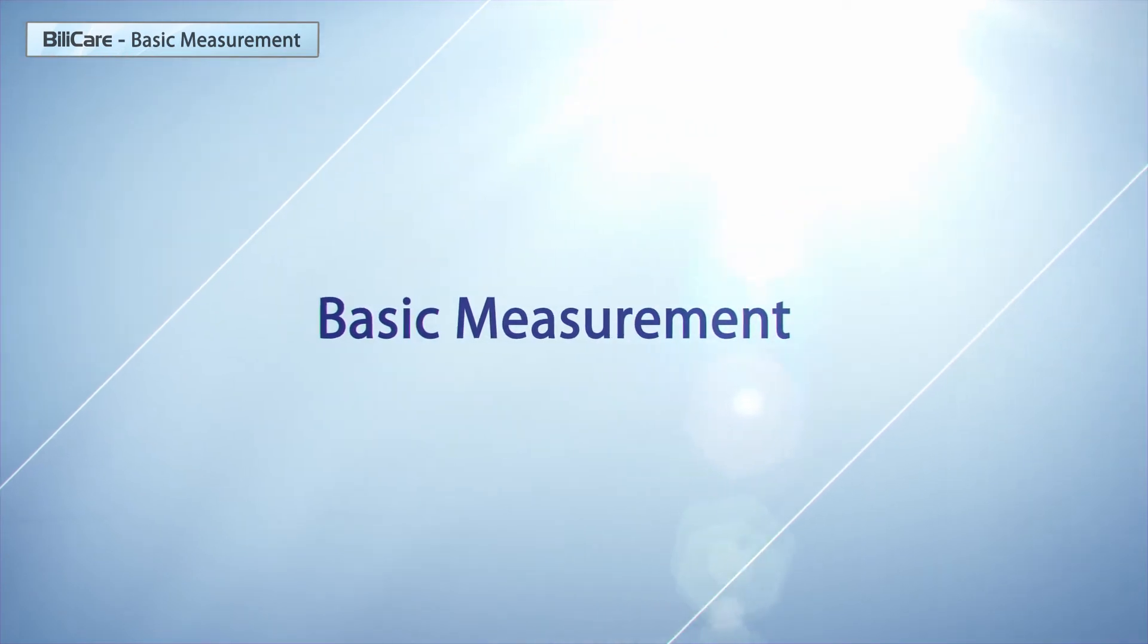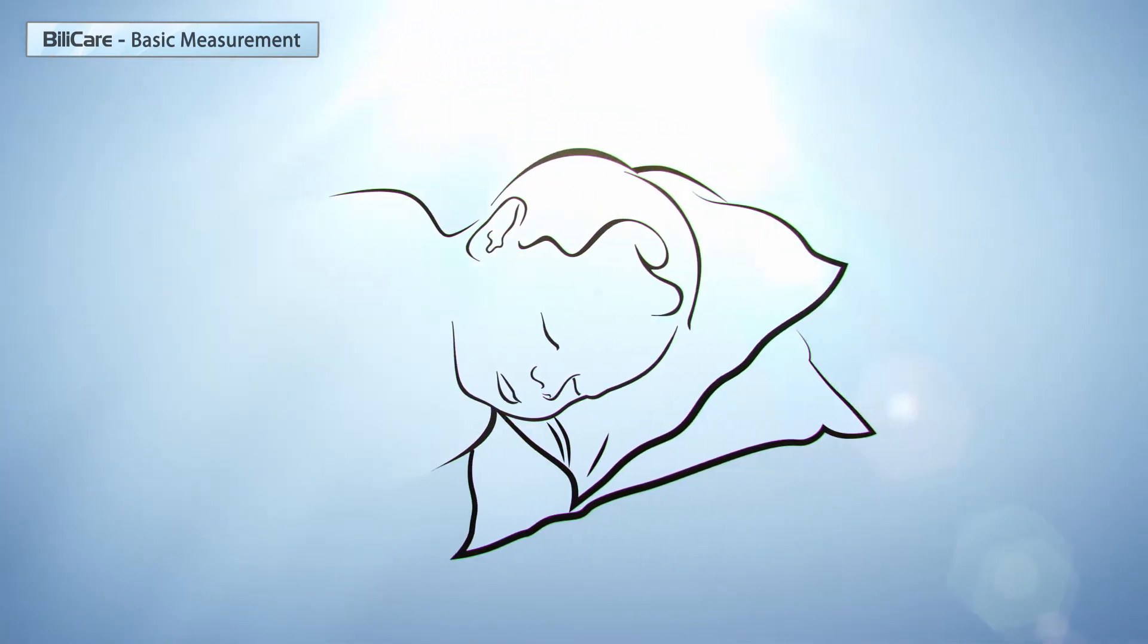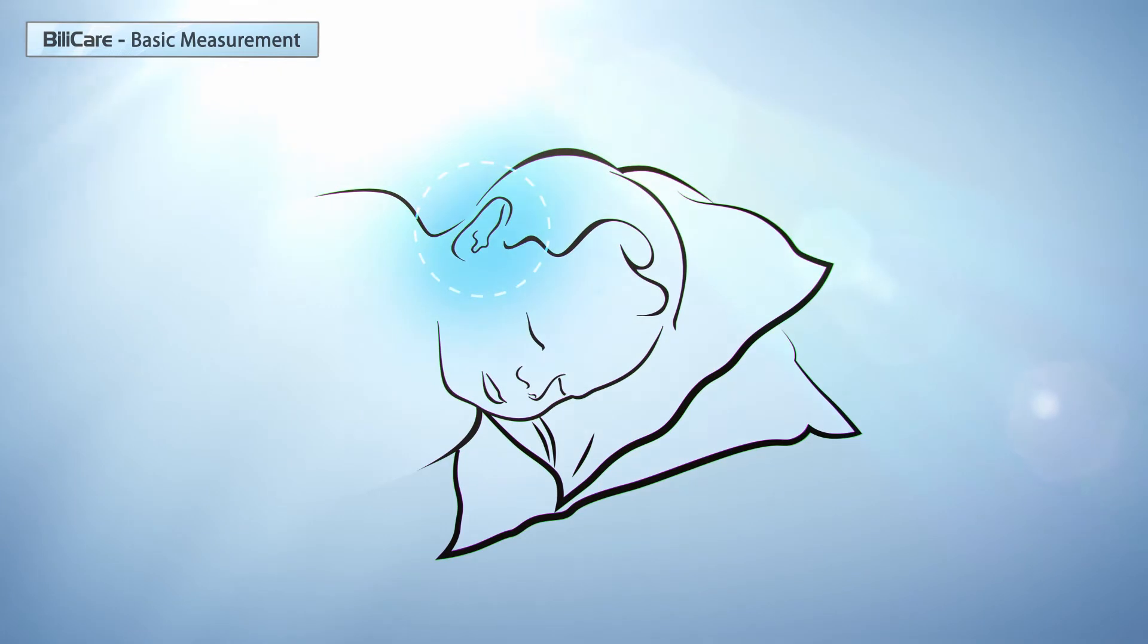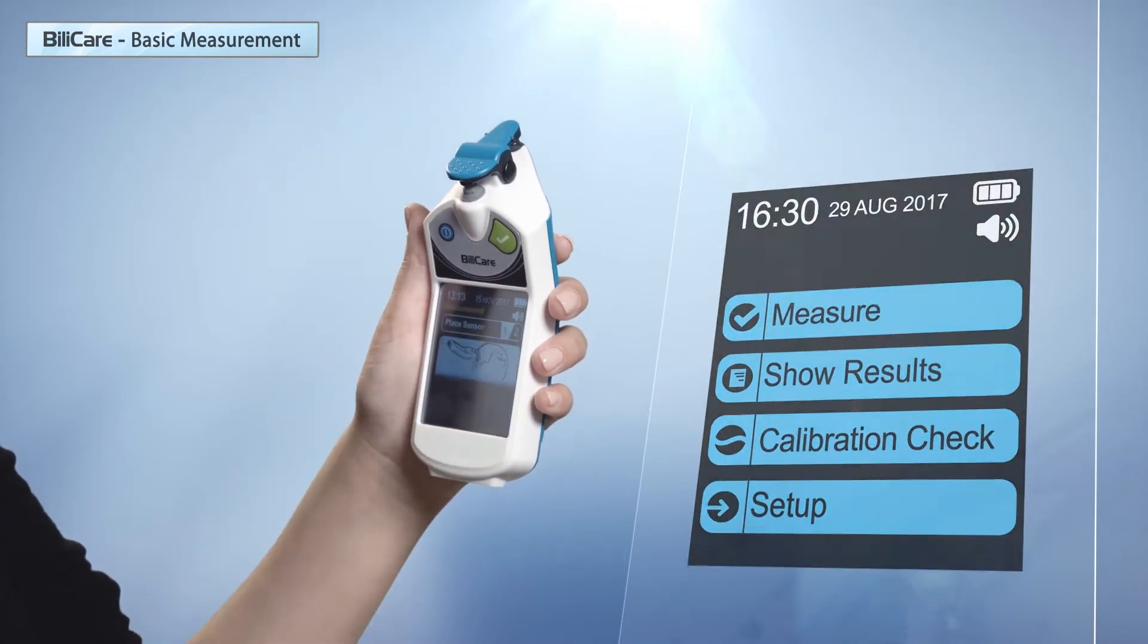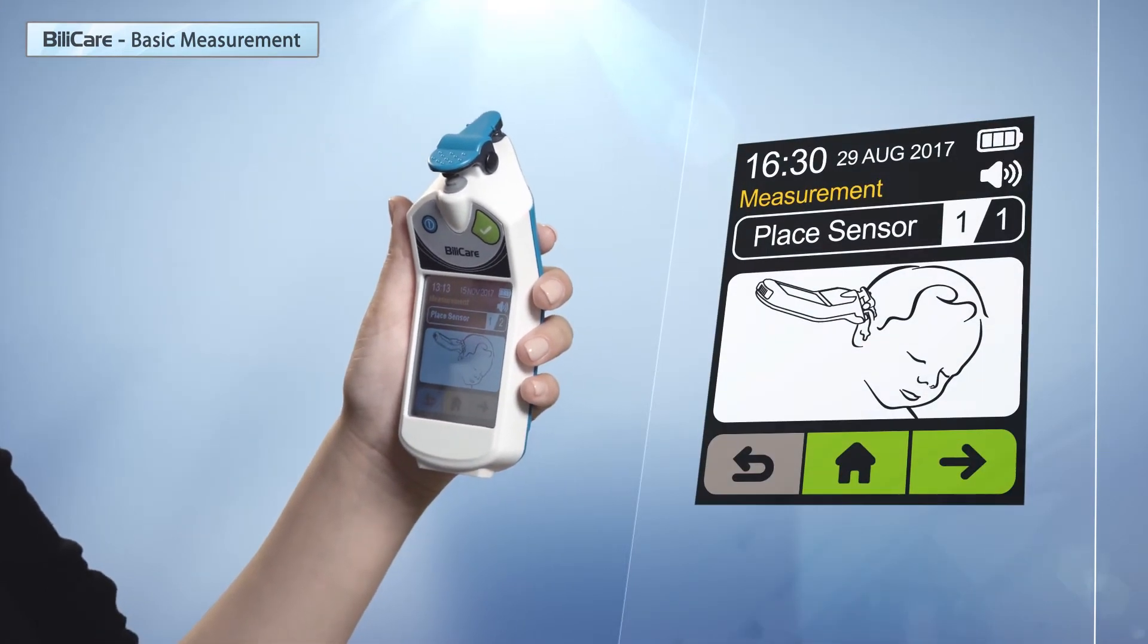Let's take a basic measurement. It does not matter which ear is used. For best accuracy, avoid using the ear on which the baby lies. Once on the main screen, press the measure key. The place sensor screen appears.